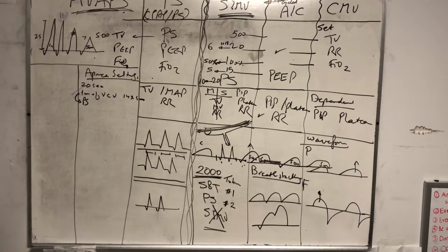And I'm sure each one of us has heard this phenomenon where somebody comes in and says the patient failed the SBT. And you don't ask how the patient failed the SBT, and you move on to the next patient. But if you ask, they'll tell you, oh, he failed because of apnea. Apnea is not a failure of the SBT, it's a failure of the respiratory therapist, or the nurse, or both, or us, the doctors too, because you didn't wean sedation or whatever. If somebody is apneic on SBT, number one, that's a great indication for me that this patient is going to be extubated. You know why? Because he doesn't want to breathe fast. He's not tachypneic. He's relaxed, too relaxed actually, right?